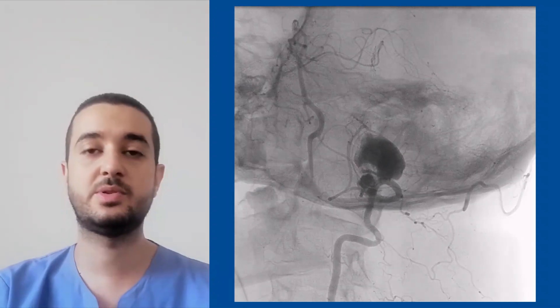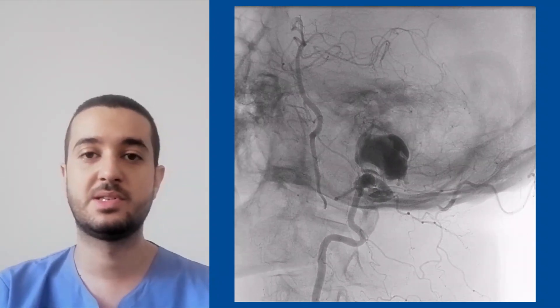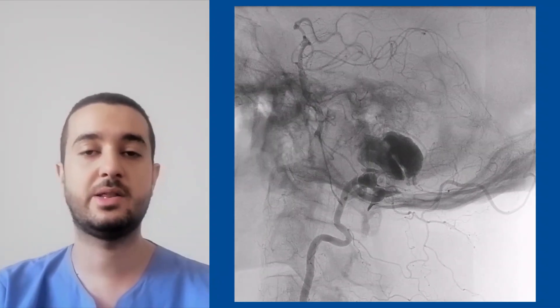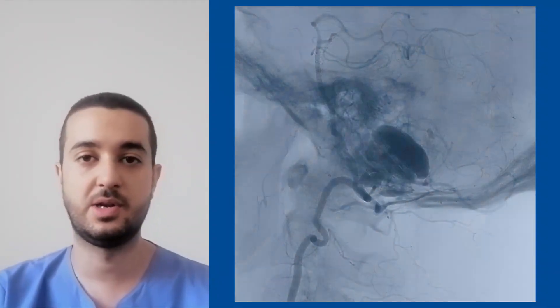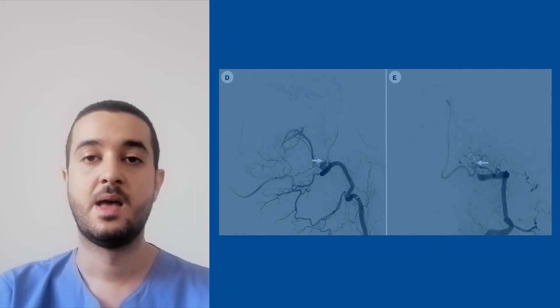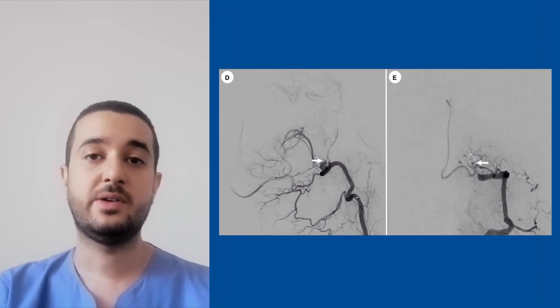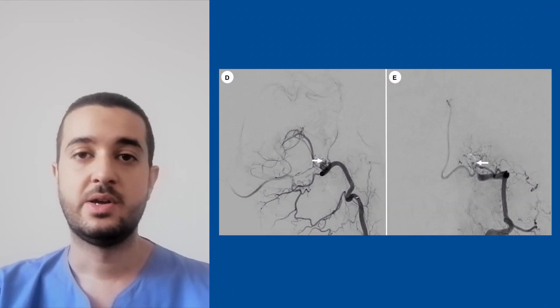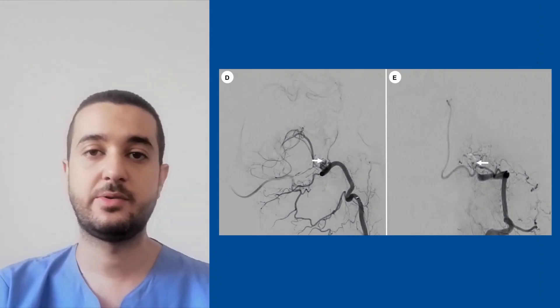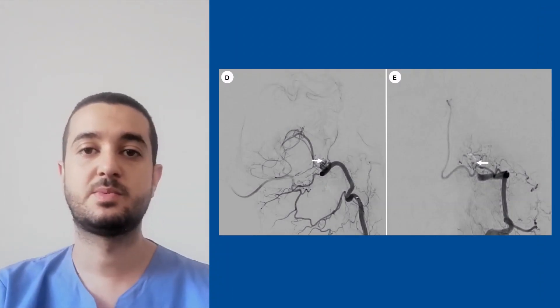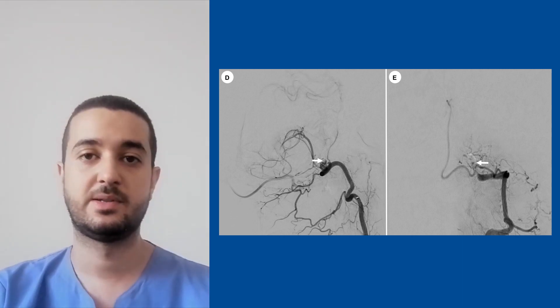We urgently proceeded to measurements, microcatheter placement, and endovascular coiling. The final angiography showed near-complete obliteration of the aneurysm with a small neck remnant.